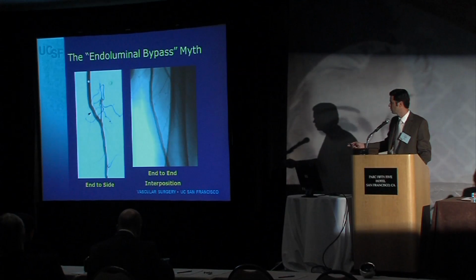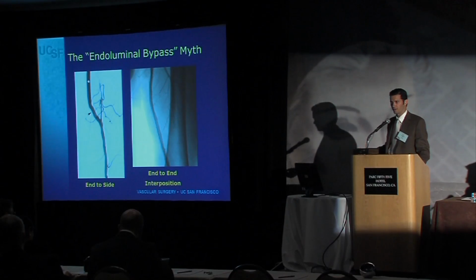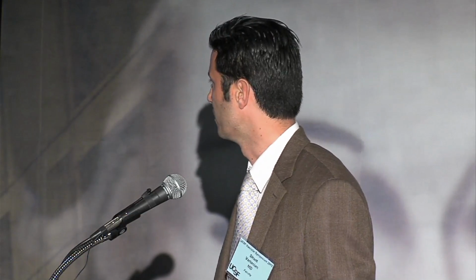to SFA collaterals, this doesn't go down. This claudicant ends up reverting back to claudication when this bypass graft goes down. When this goes down, it will thrombose until there's a prominent branch above or below, oftentimes the whole SFA. So you're fundamentally changing the anatomy in the process of doing this treatment for this patient. And that, in theory, is why we see the late adverse events when these devices fail.